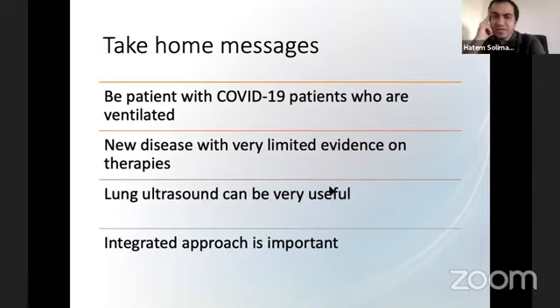Yeah, of course. I mean, if you don't have lung ultrasound, of course, you will rely on the clinical information. You will use the chest X-ray, but the idea is the same. You have to give the patient time. And as people observe, there's no evidence on that. This is all experience-based. 10 to 14 days, some people do after 7 days. If you see your patient clinically ready, hypoxia is improved, X-ray showing reduction of the infiltrations, yes, you can use the clinical and X-ray criteria and guide your extubation. Lung ultrasound is not a mandatory thing to do, but it is useful if you have it to utilize it.